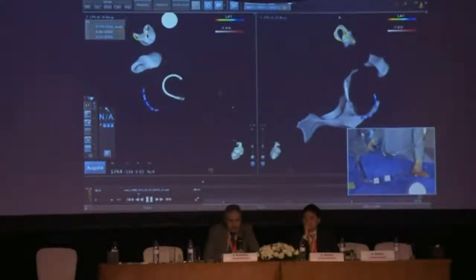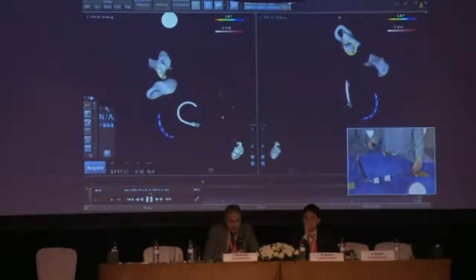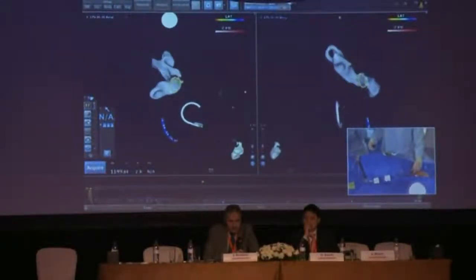My pulmonary vein catheter has gone into the left upper, so we've got a bit of the left upper and a bit of the left lower here. It's quite a big left upper with quite a lot of branches, so we can see that as we begin to show a bit more geometry there. The left upper has clearly an upper and lower branch on it, and then we see the left lower that the PV catheter's in now. So I'm just filling in that geometry.